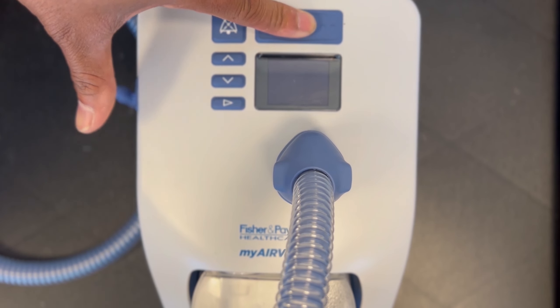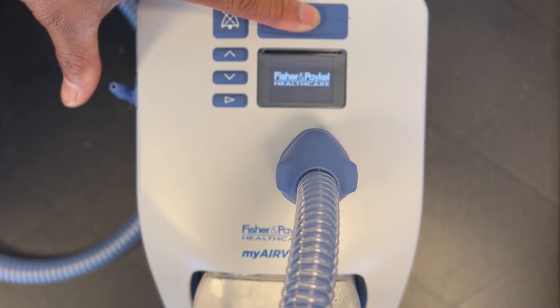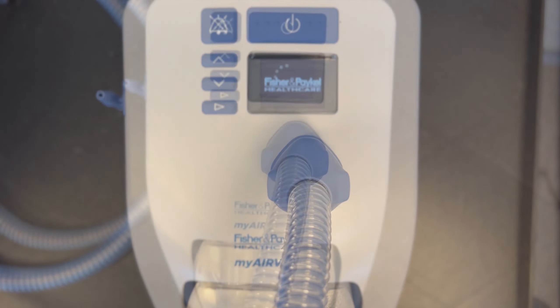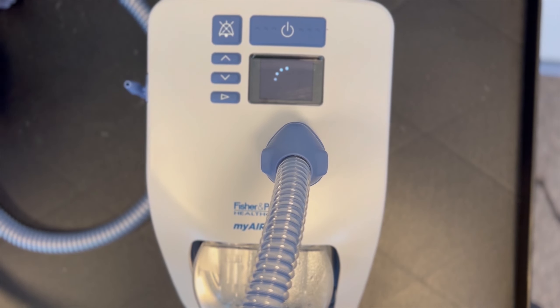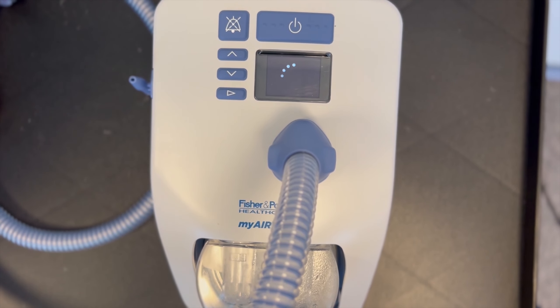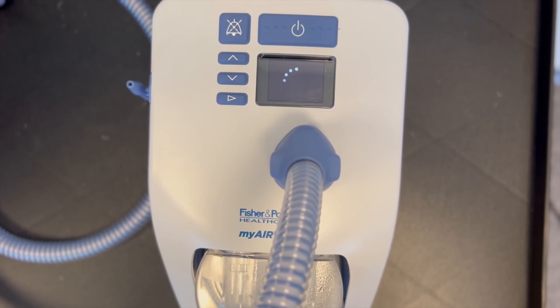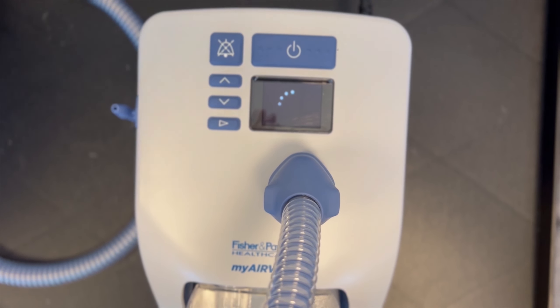To turn on the device, you press and hold the power button for five seconds and let go. Do not administer treatment until the warm-up phase is completed and the circle checkmark is indicated on the screen.